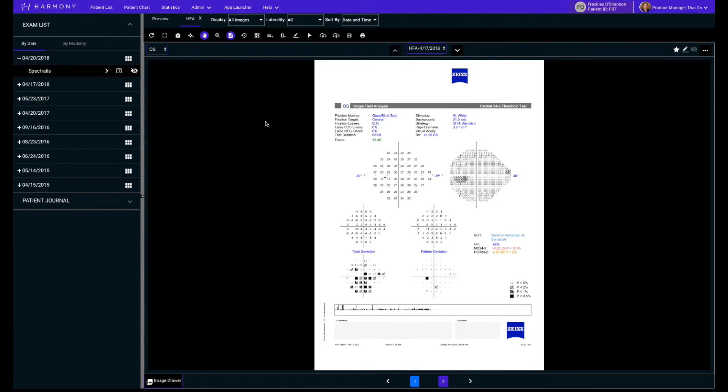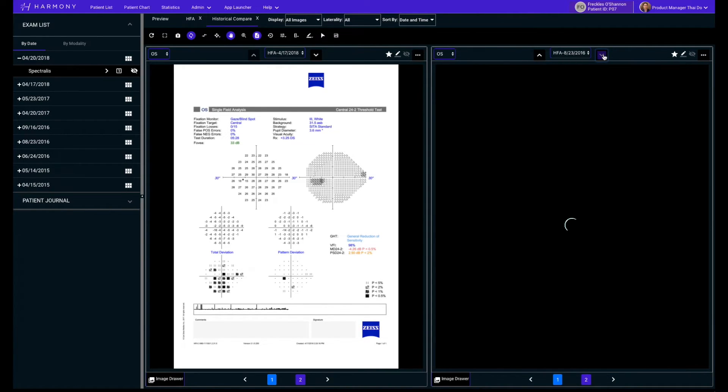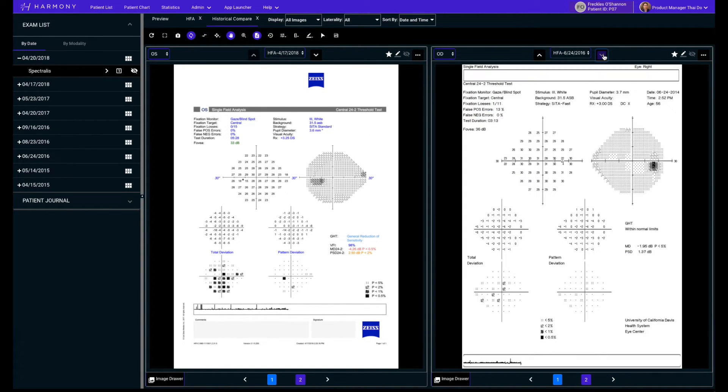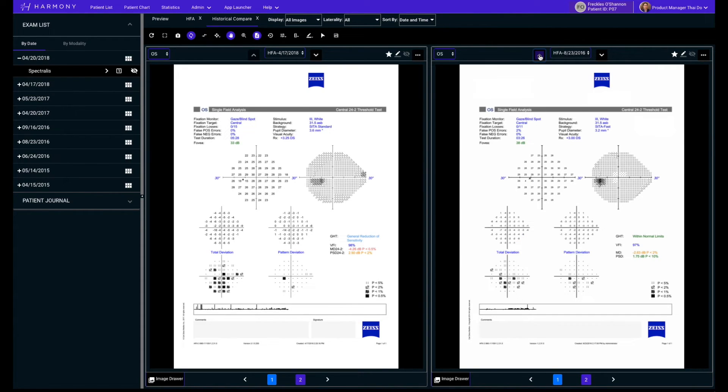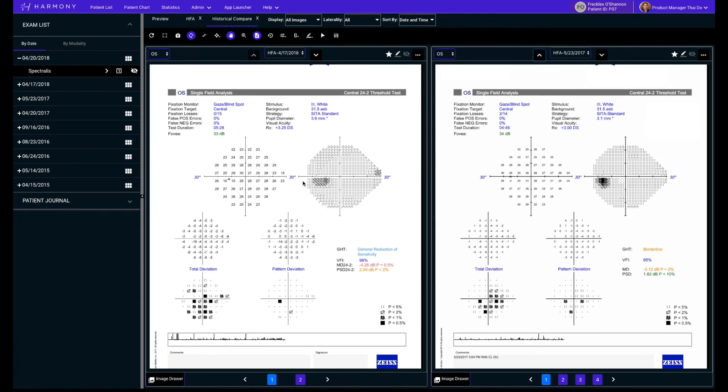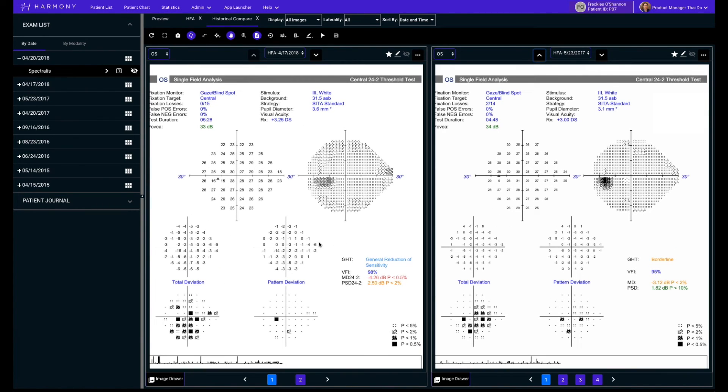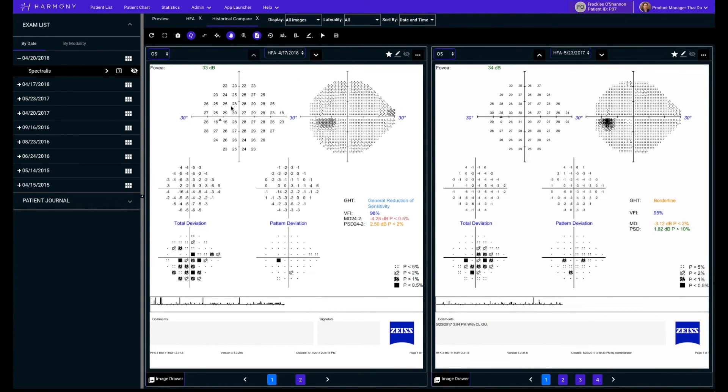Another standout feature on the toolbar is the historical comparison button. This button lets you easily and quickly perform a side-by-side comparison of the current exam and the one prior. By using the navigation arrows, you can keep the current exam in view while you flip through each of the previous exams.